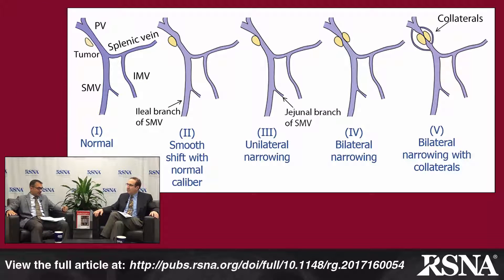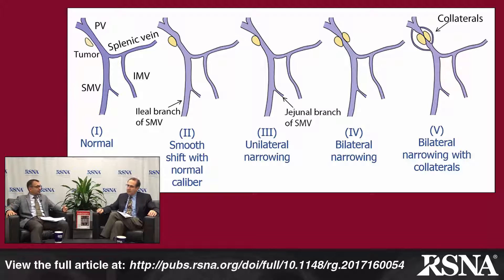If you have complete tumor encasement, there is a 100% probability the vessels are invaded. The second way, described by Ishikawa and colleagues, characterizes the relationship between the pancreatic tumor and nearby vessels based on vein caliber and length of interface as predictors of surgical outcomes. For example, a normal caliber vein, a smooth shift, or unilateral narrowing with less than 1.2 cm of craniocaudal extension is associated with more favorable surgical outcomes, versus bilateral narrowing or collateral vein formation. This emphasizes the need for multiplanar reformations to assess craniocaudal tumor extent.